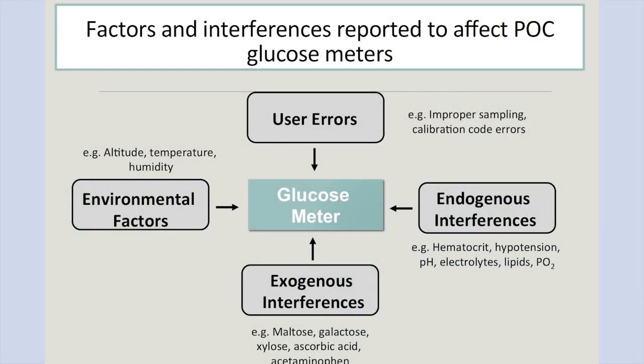And as we all know, and Nam put it, if you get a garbage sample, well, gosh golly, you're going to get a garbage result. And I'm back on my pediatric neonatal soapbox, but when we are trying to identify hypoglycemic events in those kids in those first couple of days of life, we've got to make sure that the quality of the specimen is going to be the best quality specimen. So pre-analytics, very big factor when it comes to any lab result.